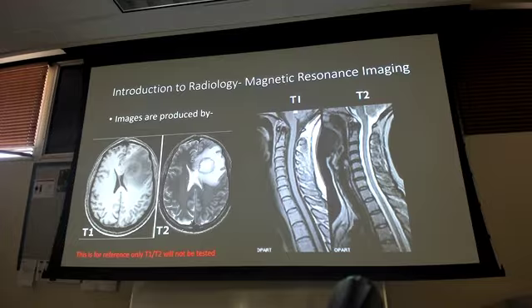But you can see the detail of the MRI from the brain scan, and then also look at my spine here. Look at how nicely that spinal cord comes down behind the vertebrae. I have my CSF on both sides, whether it's white CSF or black CSF, it doesn't matter. The point is I can make out the spinal cord, the CSF, and all the intervertebral disc spaces on this MRI.